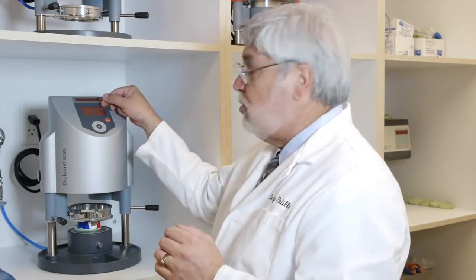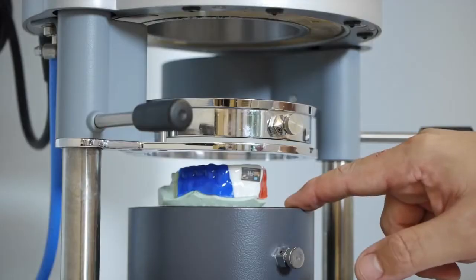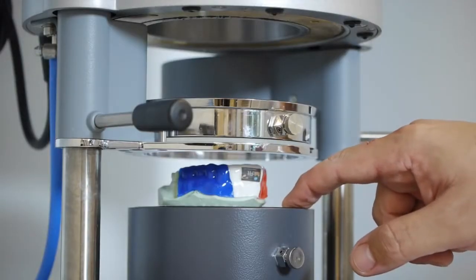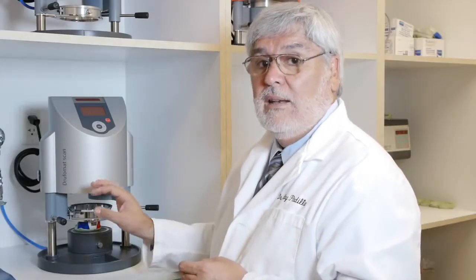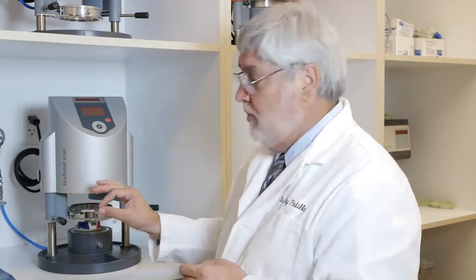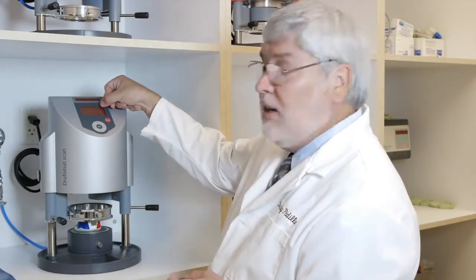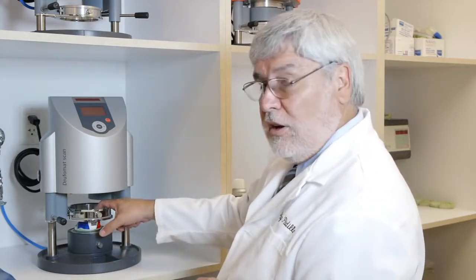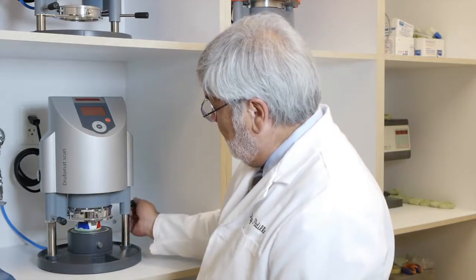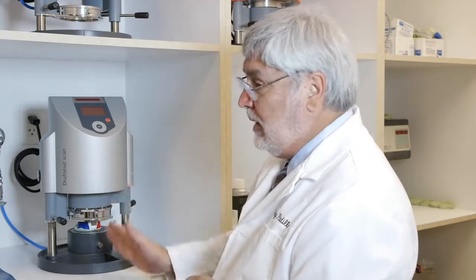So now we want this to heat an extra minute so it'll get softer, so it will laminate properly to the first layer. If you don't do this, you may not get proper lamination. So now we have it 3 minutes of heating time, 8 minutes of cooling time. Our model is over the tray. The material is over the model. The heating element now is over everything.